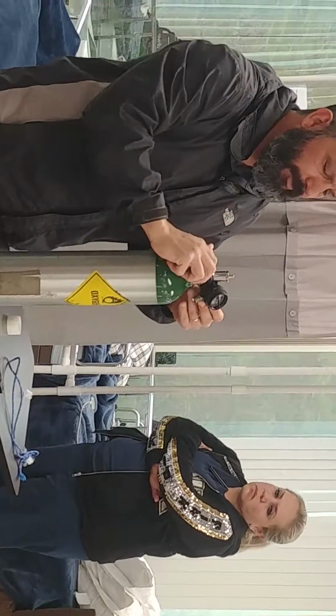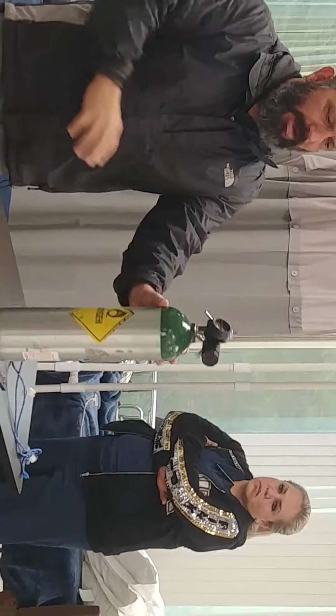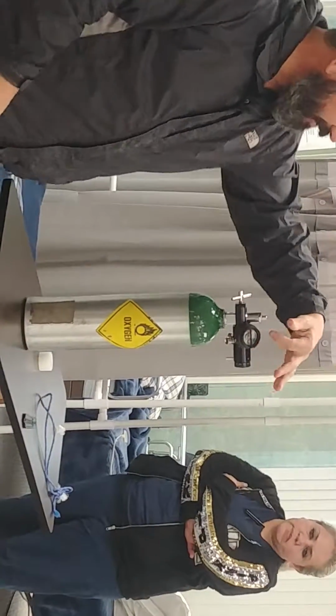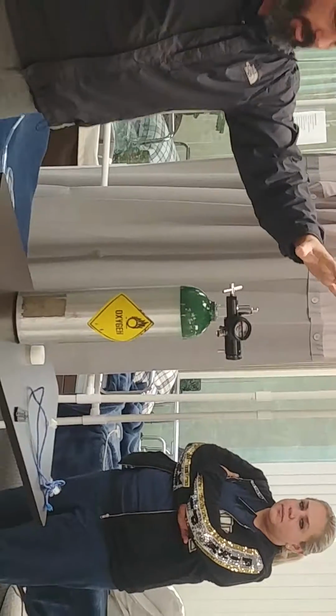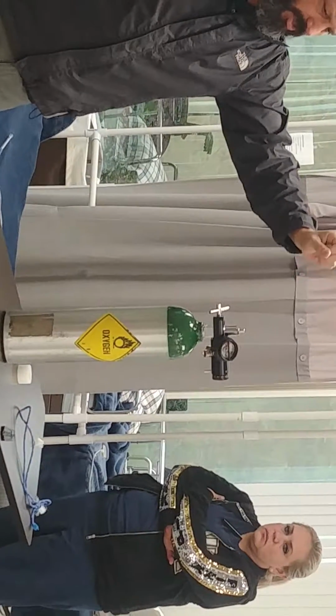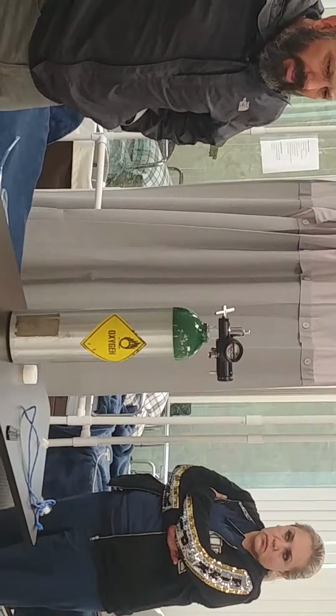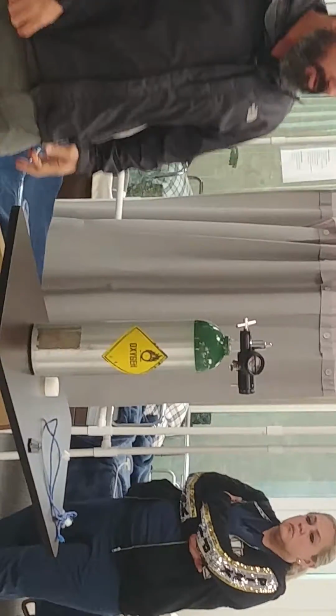Okay, so this is the bottle that we need to swap out. This is our regulator here. This is our regulator gauge. It tells us how much pressurization or how much oxygen we still have left in here. When we talk about oxygen, we're talking about liters per minute, flow rate wise.